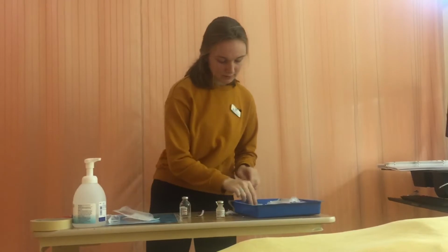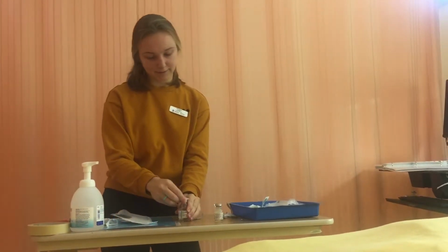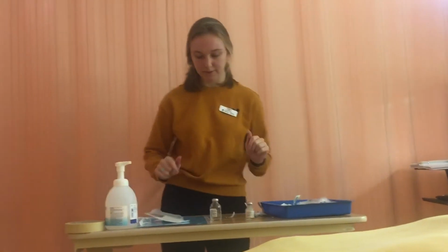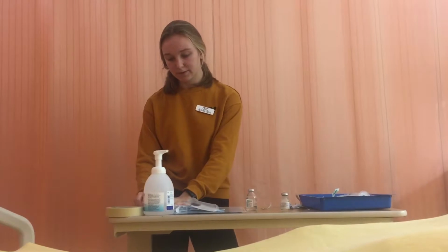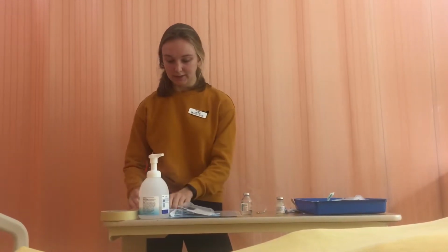So now I'm going to get a new alcohol swab, and I'm going to swab the top of the vial for 30 seconds and dry for 15, just in case I touch the top, because we don't want any bacteria getting in. And through my calculations, since we need 3 million units and I had 5 million units, I've calculated that we need 6 milliliters, because 3 million divided by 500,000 is 6 milliliters.